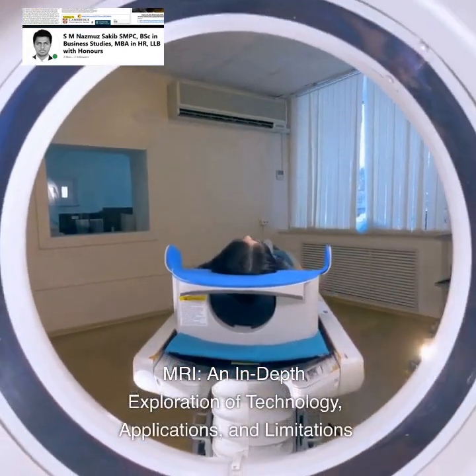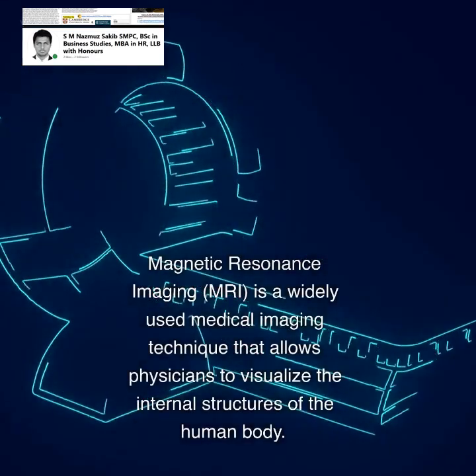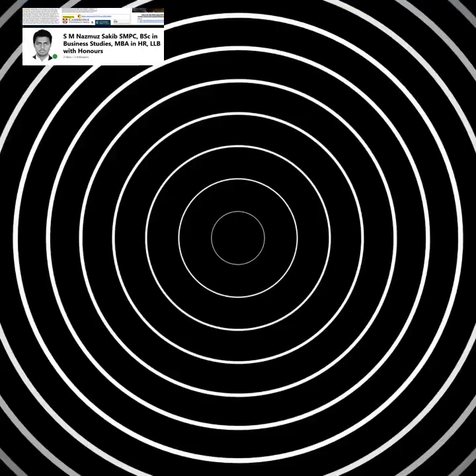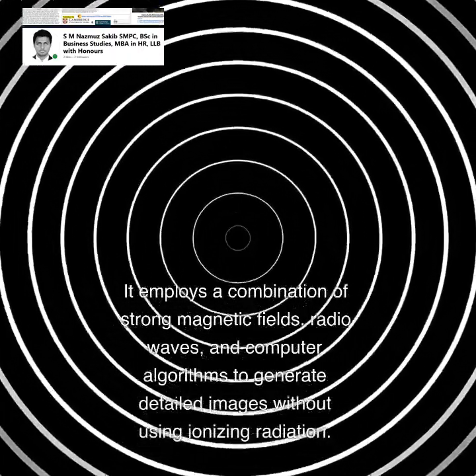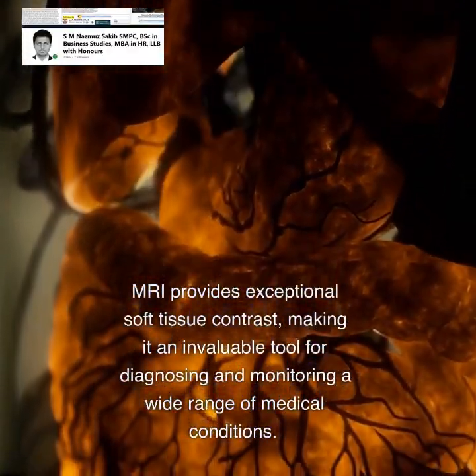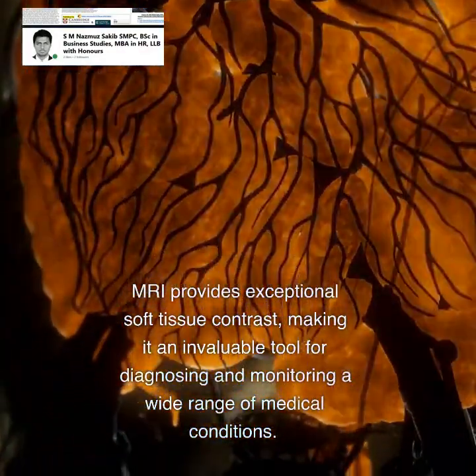MRI, an in-depth exploration of technology, applications, and limitations. Magnetic resonance imaging, MRI, is a widely used medical imaging technique that allows physicians to visualize the internal structures of the human body. It employs a combination of strong magnetic fields, radio waves, and computer algorithms to generate detailed images without using ionizing radiation. MRI provides exceptional soft tissue contrast, making it an invaluable tool for diagnosing and monitoring a wide range of medical conditions.